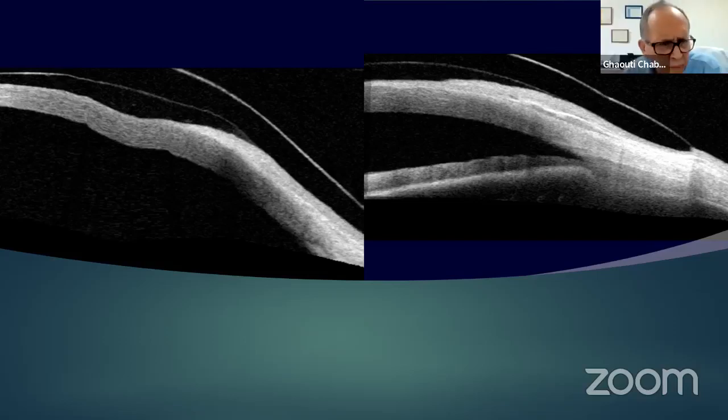For the people who have had herpes zoster, herpes, or adenovirus conjunctivitis, and they have an irregular surface, some people are thinking that putting contact lenses, even scleral lenses, will put the cornea at risk. What do you think about this? I don't think so. If the lenses fit well and you follow the patient along, everything has a risk, but you have to take into consideration the risk-benefit ratio. And when it comes to these compromised corneas, the risk-benefit ratio is definitely going to be in favor of the patient. So as long as the patient is being watched, monitored, I don't think there's anything to be concerned about.